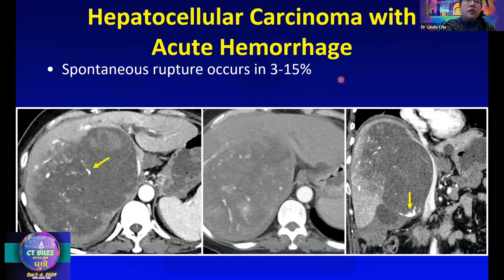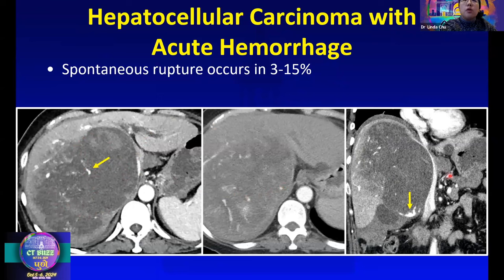HCC can also spontaneously bleed. This is a large mass in the right hepatic lobe, and you can appreciate foci of active contrast extravasation. Spontaneous rupture can occur in up to 15% of cases and carries a very poor prognosis.